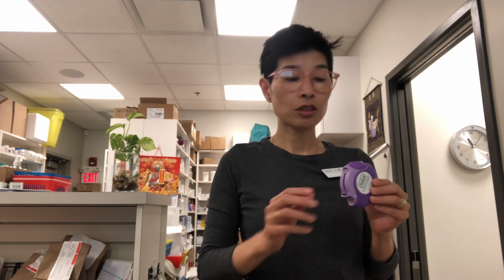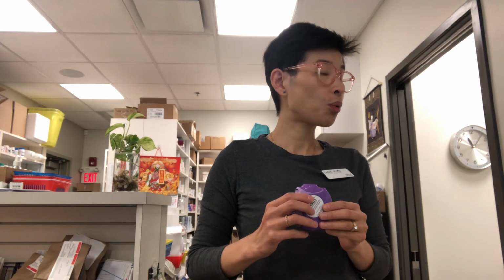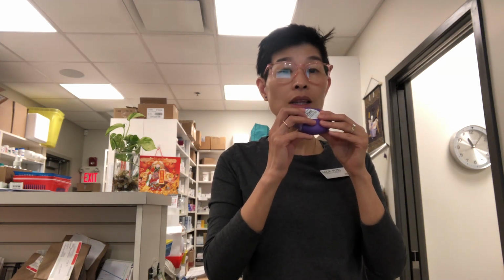Number two, you want to seal your lips around this and suck in, inhale lightly. You don't want to suck really hard because if you do, it's going to end up in your stomach and not where it should be, which is the lung. So what you want to do is seal your lips around this and just inhale lightly.